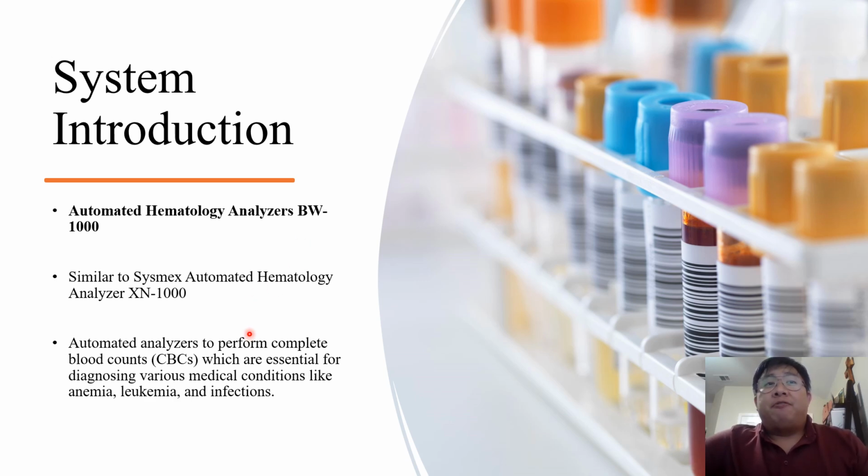So the function of the automated analyzer is to perform a complete blood count, like a routine annual health check every year, which is essential for diagnostics in any medical condition that involves hematology, like anemia, leukemia, and infections.